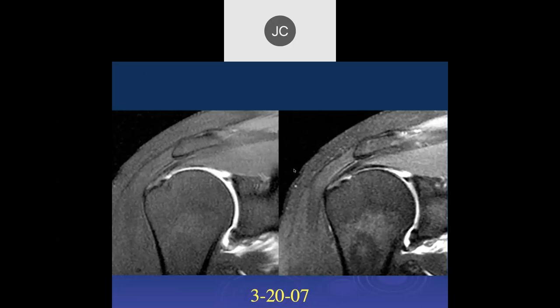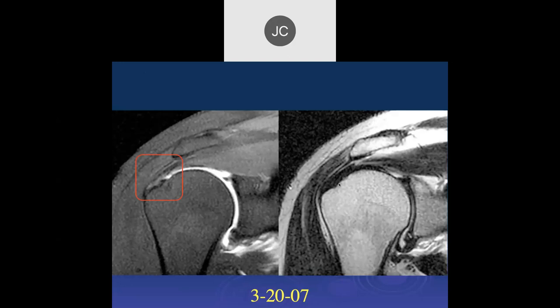There is a mid-grade articular surface footprint tear right in that area. Looking at the T2, it looks intact. So I'd call this tendinosis at this point — but it's not normal tendon. This is from 3-2007, and fast-forwarding a year and a half, a tear has developed within that region right at the insertional footprint extending a little into the tendon.